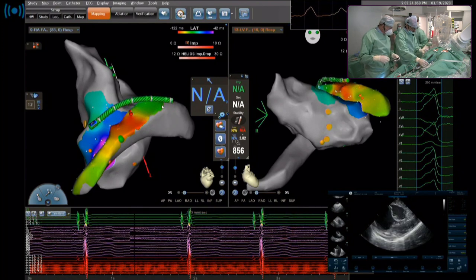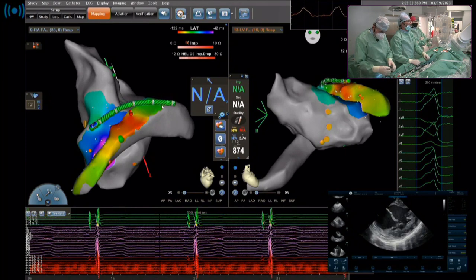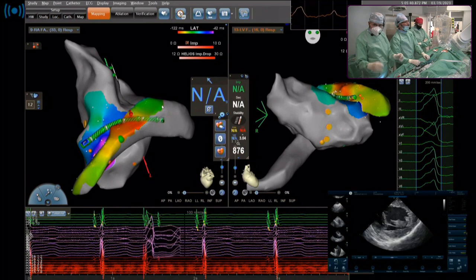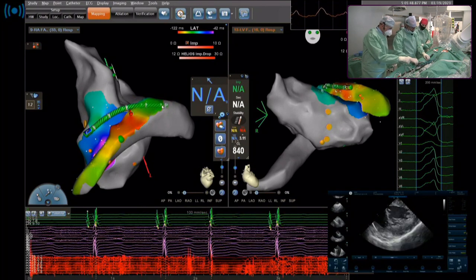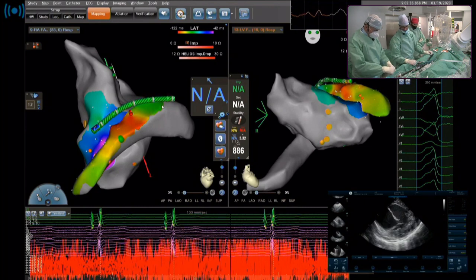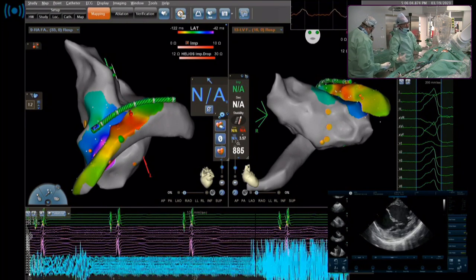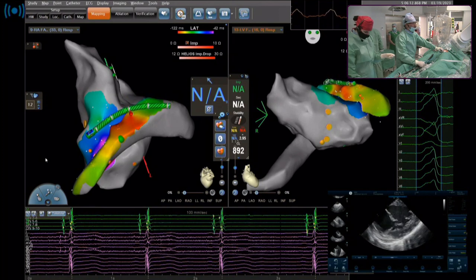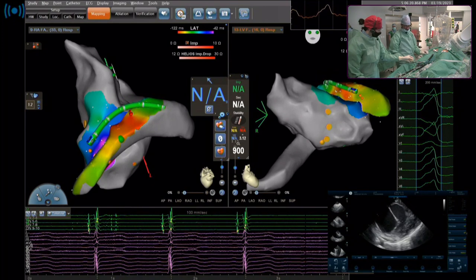We're taking the EP star out and leaving the LIMA where it is. To clarify our procedural approach: I have an Agilis in the main CS, a LIMA catheter distally, and the decapolar in there. If the decapolar becomes too much of a disruption we'll take it out. We need a 2x6 balloon over the wire and will advance both the wire and the balloon together.